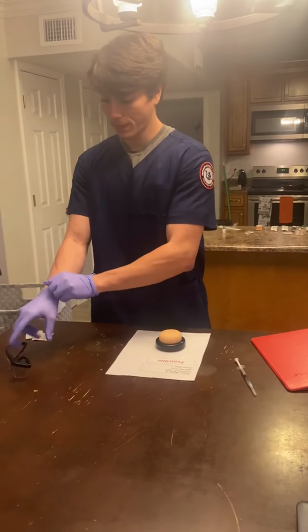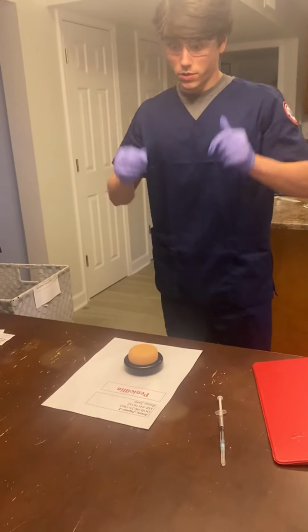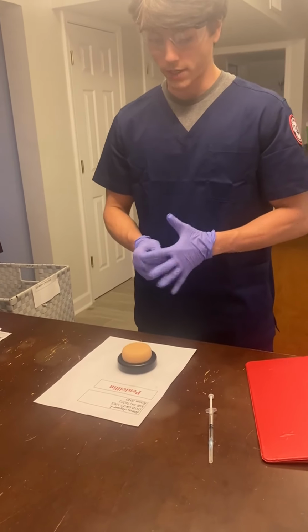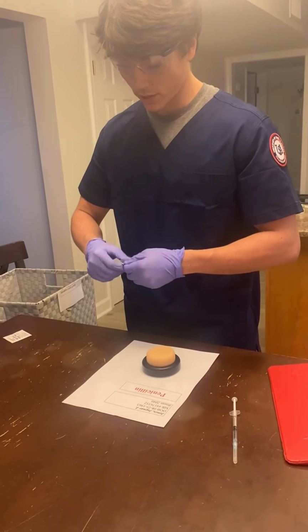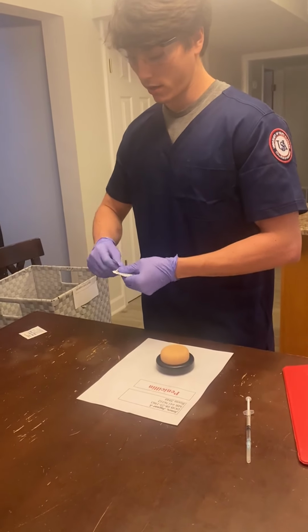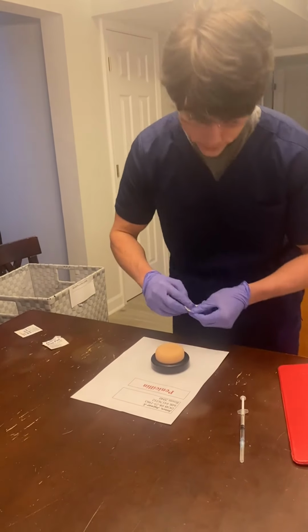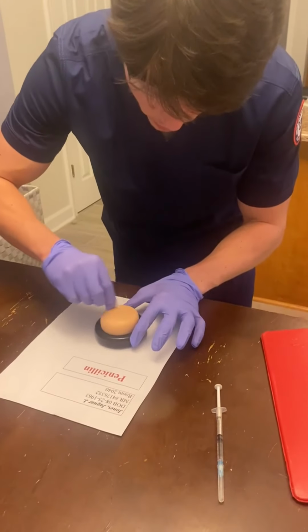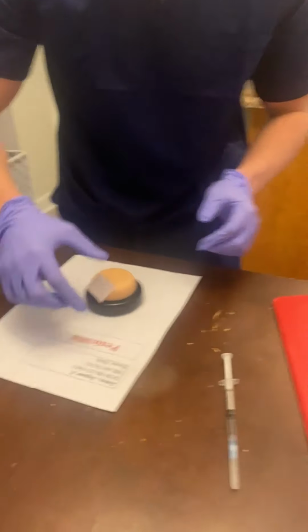All right. And so now that I've done that, I'm going to identify the correct location, which is the abdomen for this procedure. I'm going to go ahead and sterilize the area, starting from the inside and moving outward. All right, and I'm going to leave that right there.